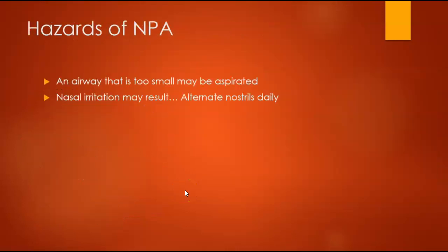So a few hazards of nasopharyngeal airways is if you put in one that's too small, it might end up getting aspirated further into the airway. And then that nasal irritation, if these are going to be used long term, you have it in place. You want to make sure you're alternating nostrils daily so that you don't cause any skin breakdown.